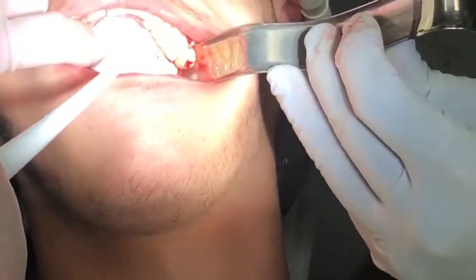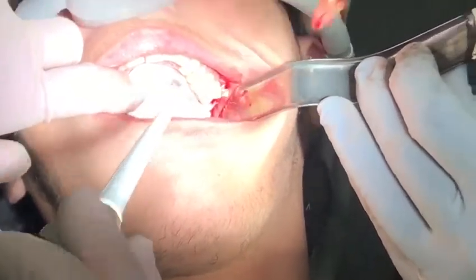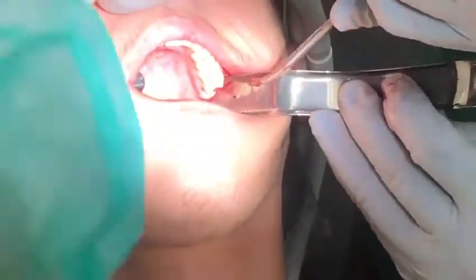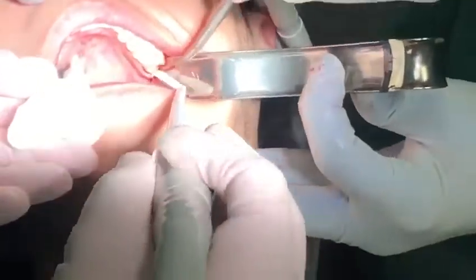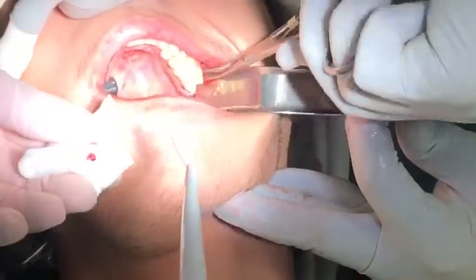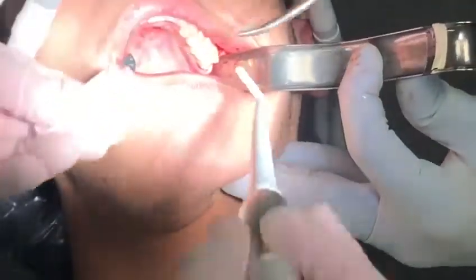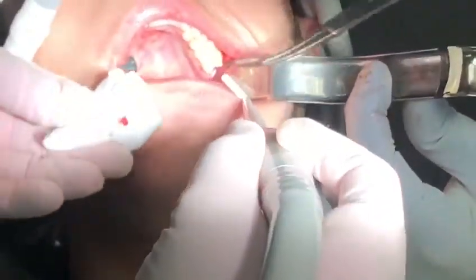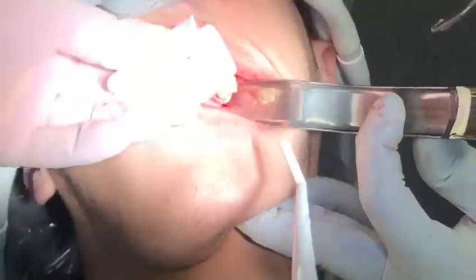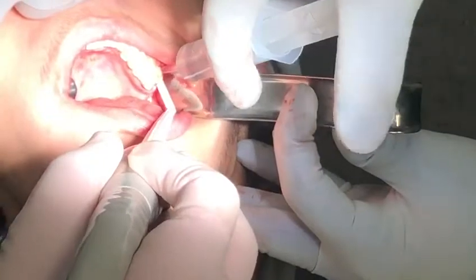Let's grab this and take it out — take it out now, bring this side, another side, come through, then take. Excellent, just a touch of rims here — there you go.